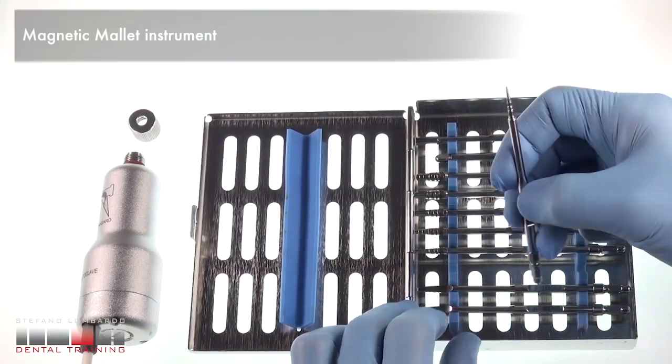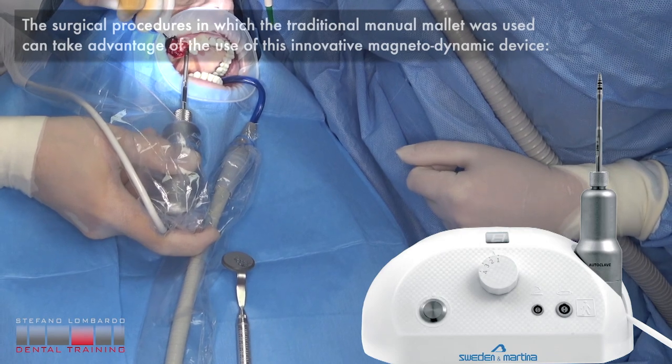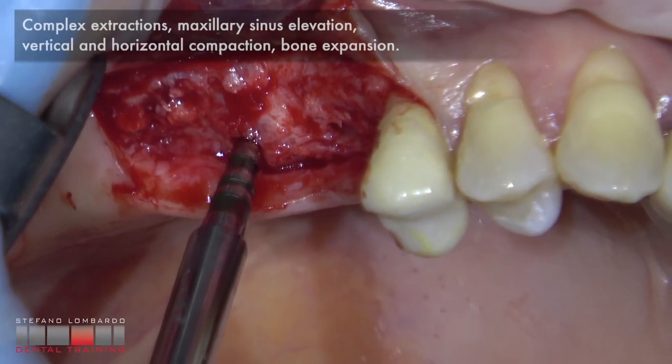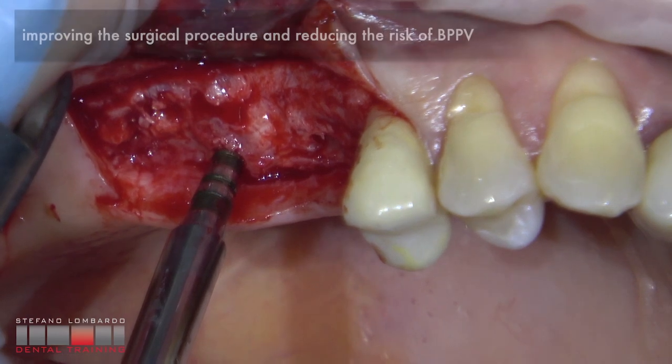The magnetic mallet is a completely innovative device for oral and implant surgeries. The surgical procedures in which the traditional manual mallet was used can take advantage of this innovative magnetodynamic device. Applications include complex extraction, maxillary sinus elevation, vertical and horizontal compaction, and bone expansion.